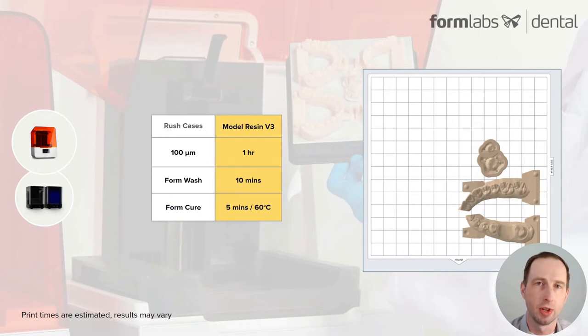Dental laboratories and businesses need the ability to handle rush cases. When that case has got to go, you need to have that crown or part or whatever it might be as fast as possible. In this print example, I'm showing this Quadrant Model kit, and it prints in about an hour. With post-processing, you're able to have this model kit ready to go in about an hour and a half.